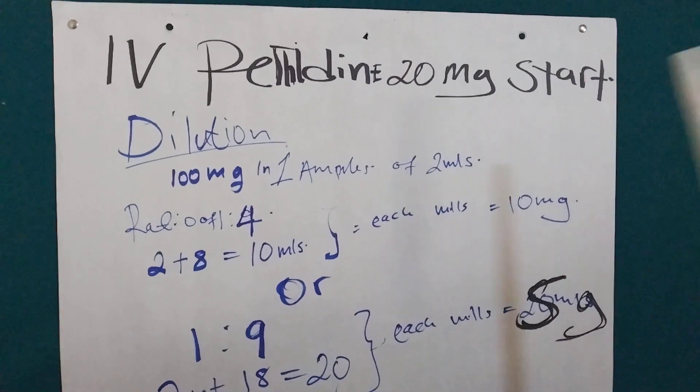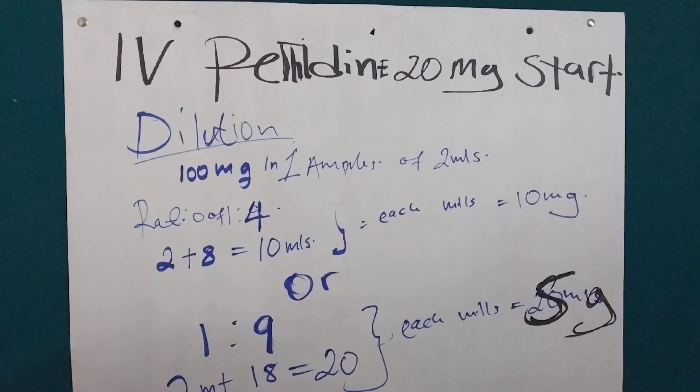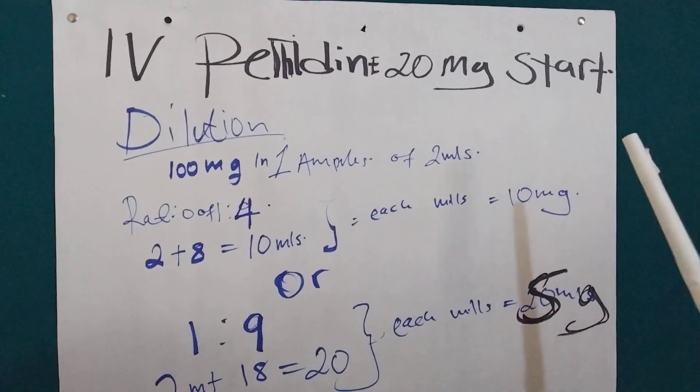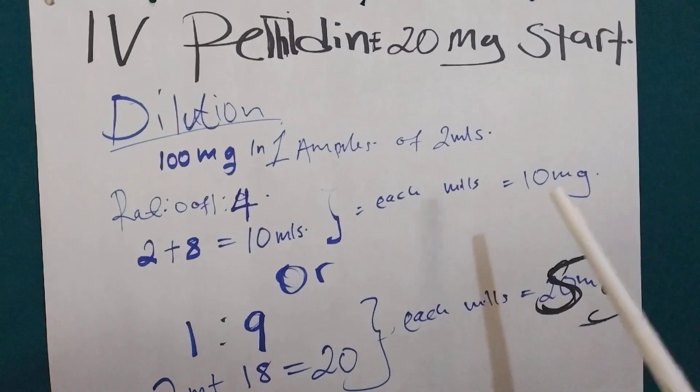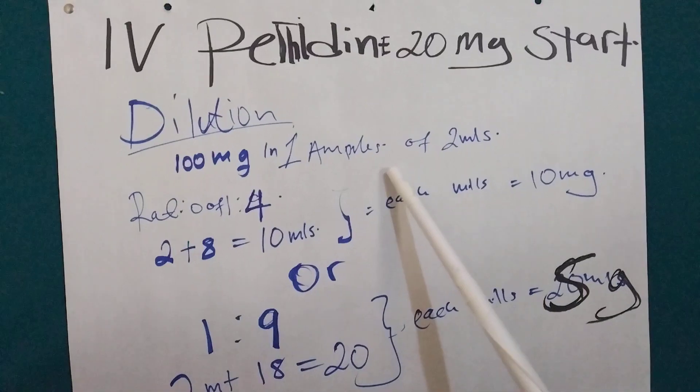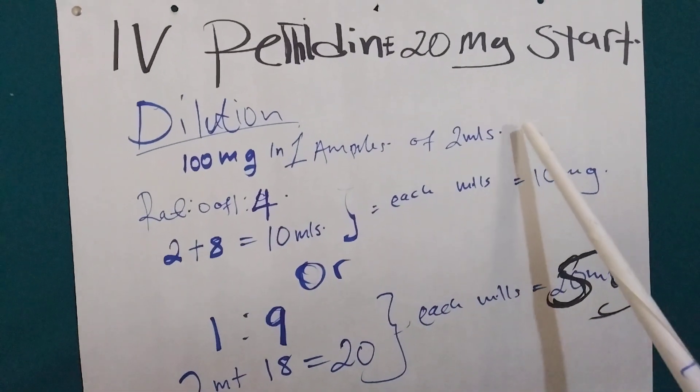I'm going to show you how we dilute and give the prescribed milligram. So, on dilution, we first check the ampoule. The one we have, one ampoule contains 100 milligrams in 2 mL.